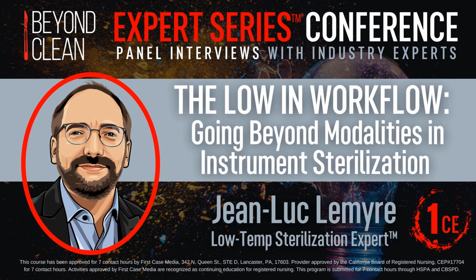Yeah, I think that perspective on microbial life is important and needed. I'm thinking back to my time working in sterile processing departments, and we would have, say, a plumbing issue in the decontamination area, and the facilities guys would come in with no PPE on and just start grabbing decontam sinks and working on plumbing. You'd have to go and ask them to please put some PPE on while they're handling these surfaces, and they're like, nah, I've been doing this for 20 years, it's not going to hurt me. So you explain the risk of the invisible. That's right. It's very human to not be concerned about things we don't see or smell, but it's really the case for microorganisms and pathogens.